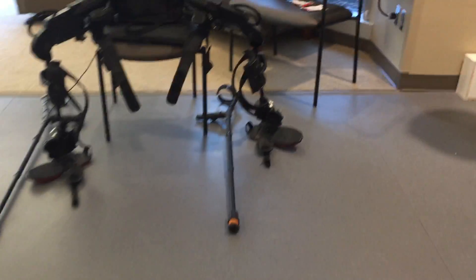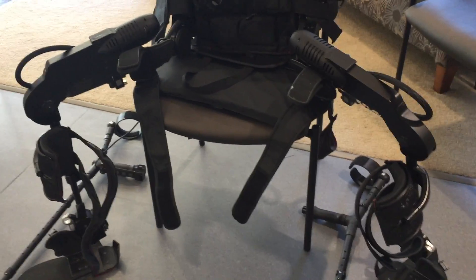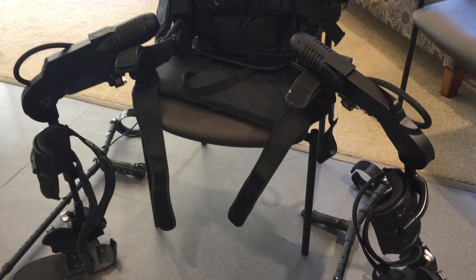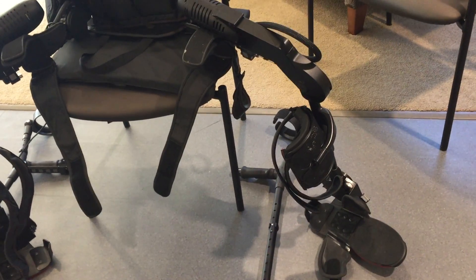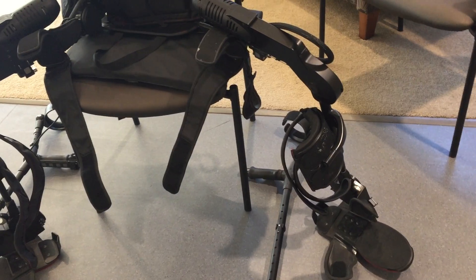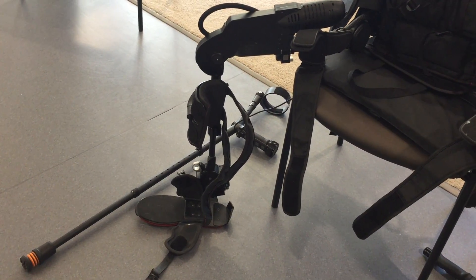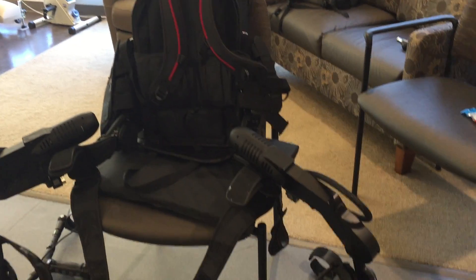The suit does work with a reciprocal pattern. The patient is responsible for weight shifting left and right and meeting a trajectory target forward, so that when they go through the swing phase of gait they have shifted their weight appropriately to take a corrective step and repeat that process left and right.